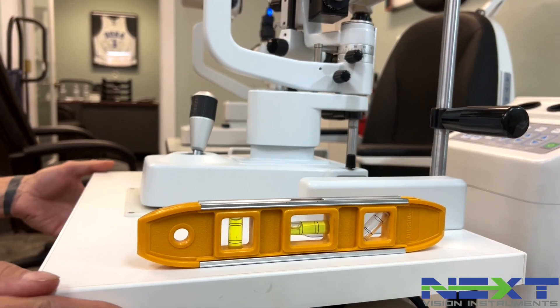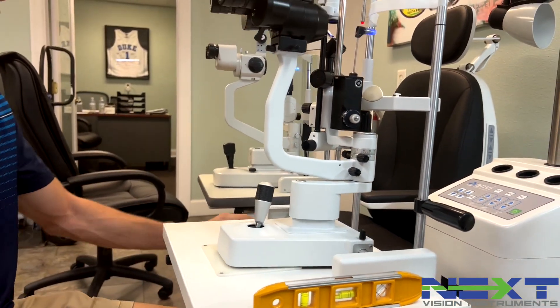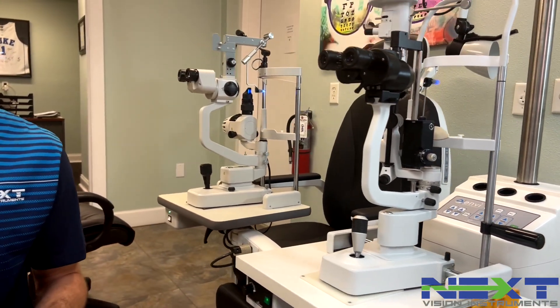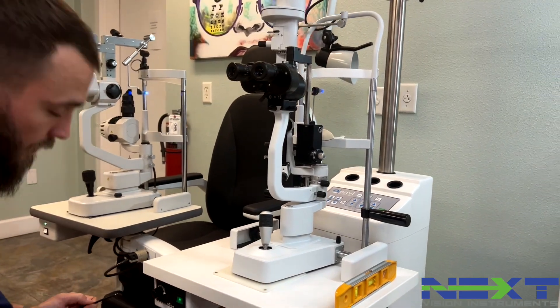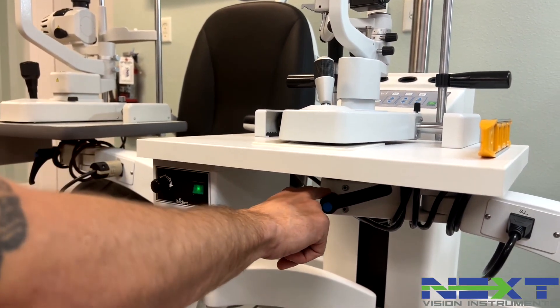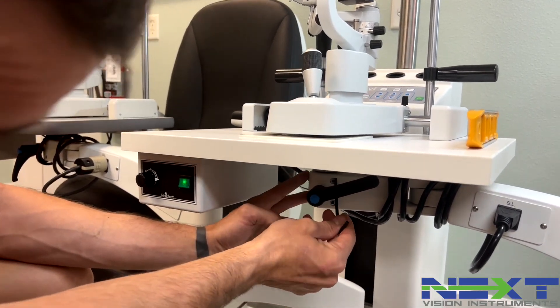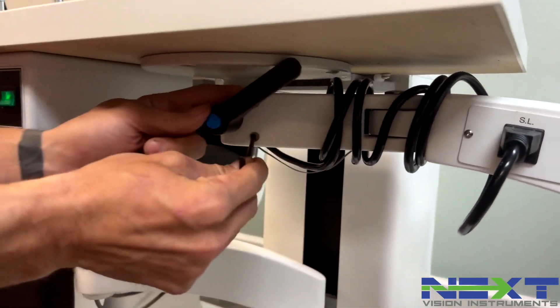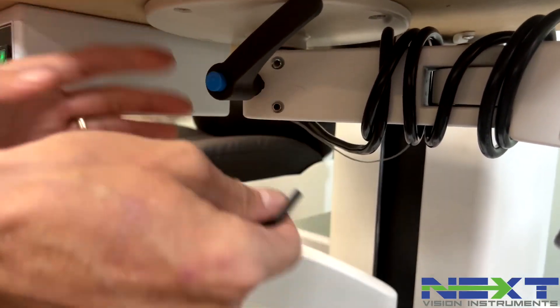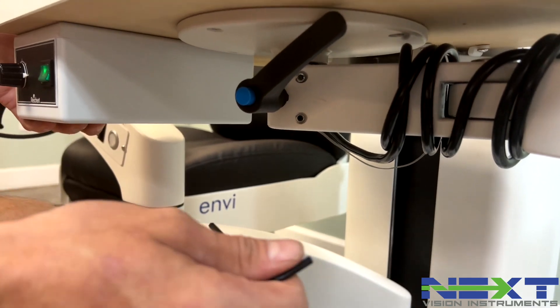The first thing you want to do is move the slit lamp into position right in front of the patient chair, as if you were examining a patient. You also want to make sure that the slit lamp locking knob is loose, so that when you adjust these Allen screws — which is how we're going to make the slit lamp level — it has the ability to move and not get locked into place.